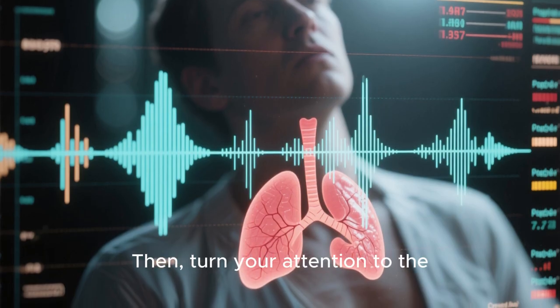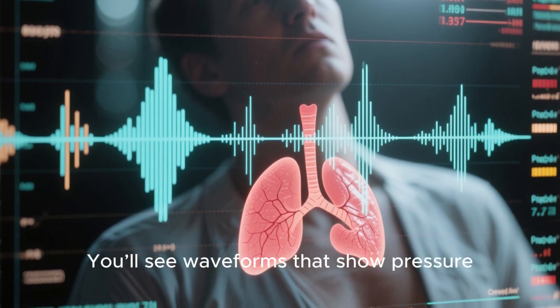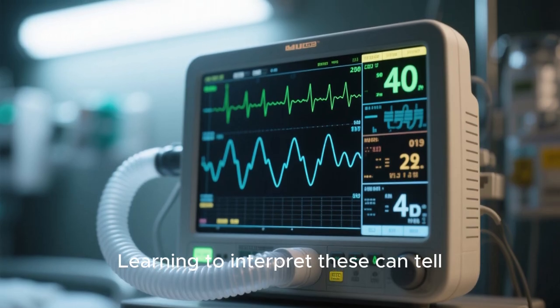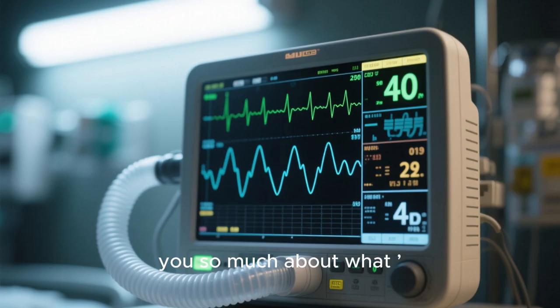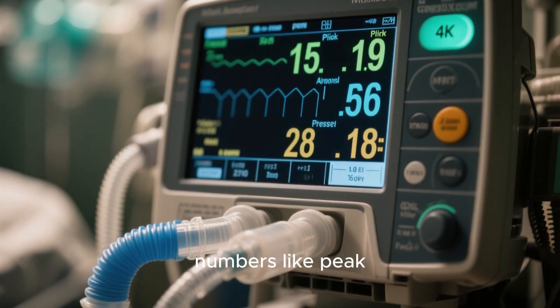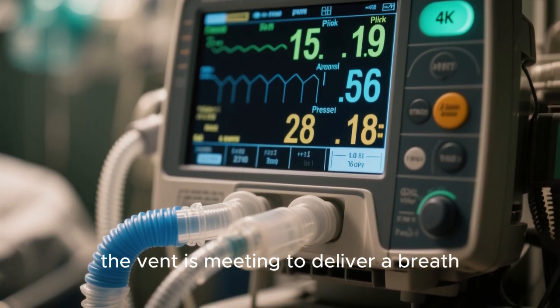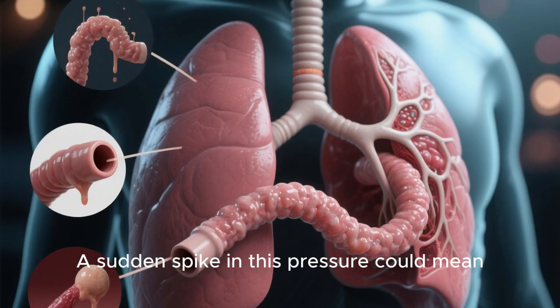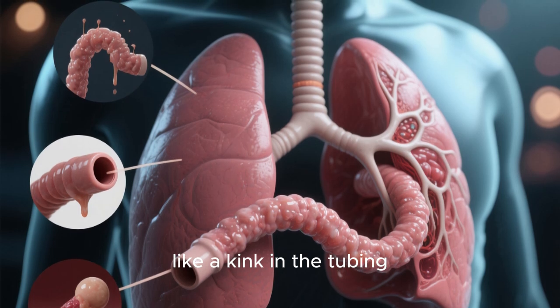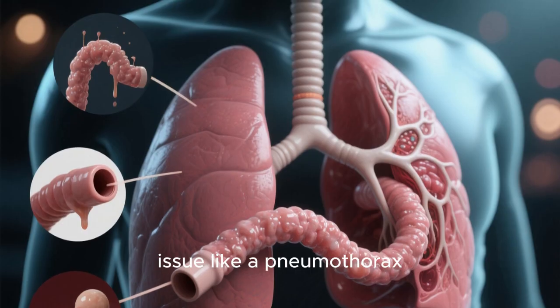Then turn your attention to the ventilator monitor. You'll see waveforms that show pressure, flow, and volume with each breath. Learning to interpret these can tell you so much about what's happening with your patient's lungs. You'll also monitor key numbers like peak inspiratory pressure, which tells you the resistance the vent is meeting to deliver a breath. A sudden spike in this pressure could mean there's a problem, like a kink in the tubing, a mucus plug, or a more serious issue like a pneumothorax.